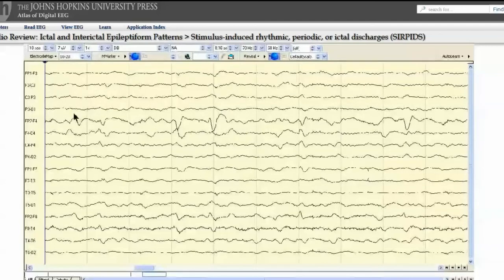Now, however, we see the appearance of blunted waves more frequently in the same region that the epileptiform discharge was seen previously. In the first 5 seconds, 5 such potentials have appeared of varying morphology, but essentially all on the theme of a field with sharp or blunted slow wave characteristics.